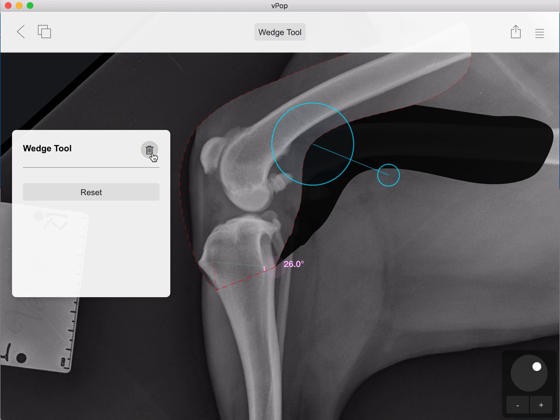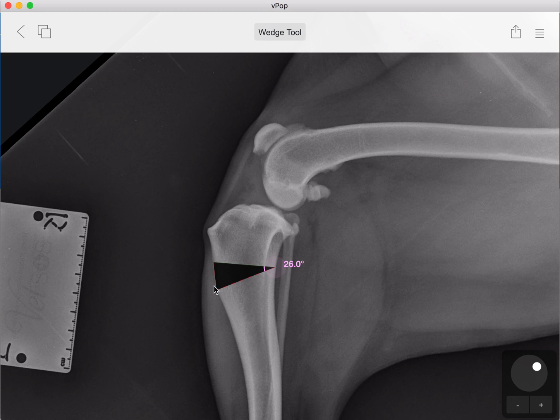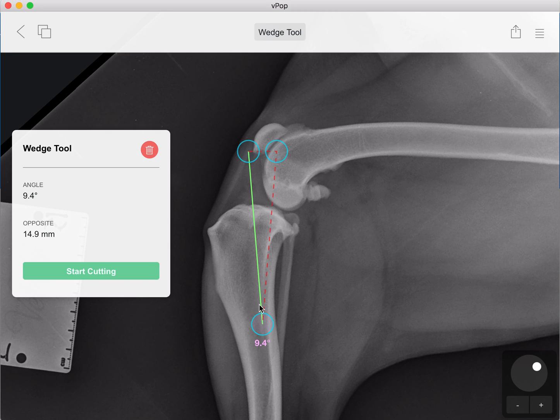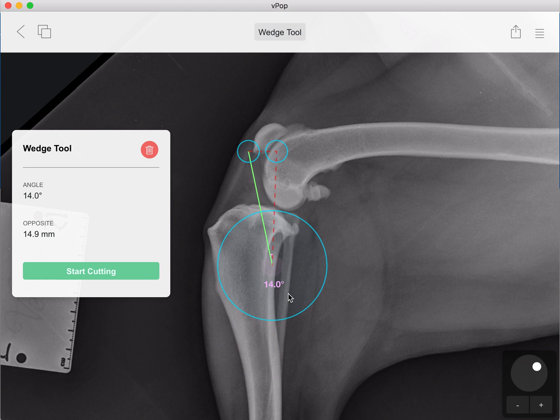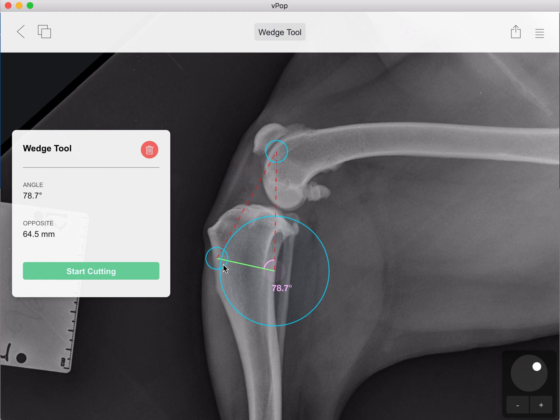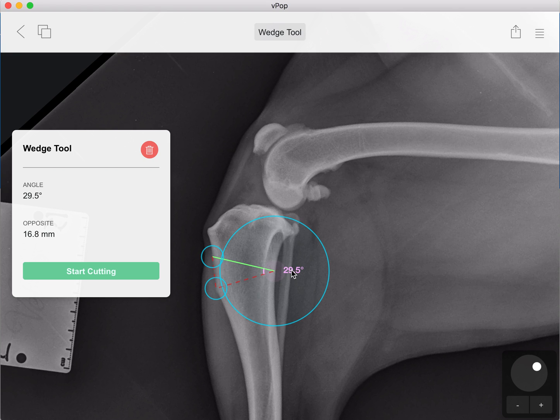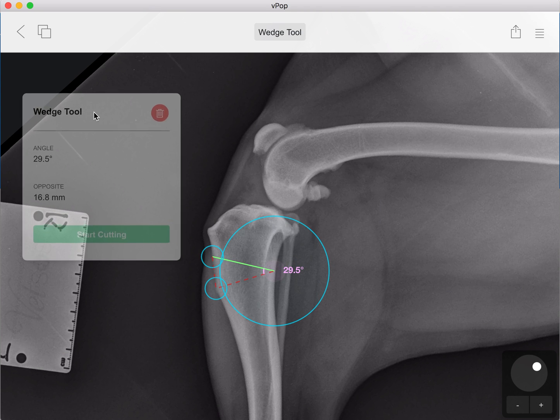Now let me explain the significance of the green and the red line. The green line is where you delineate the fragment that you want to move. We're positioning our apex, positioning our green line, and then the second side of our ostectomy. Our base is displayed here and our angle is displayed here on our smart palette — that's your point of reference, and if it's in the way you can move it around wherever you need it to be on the screen.